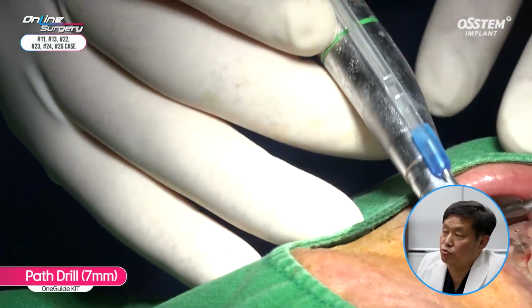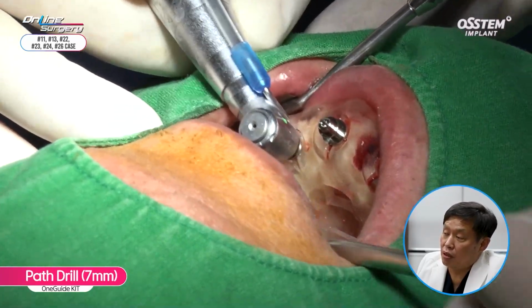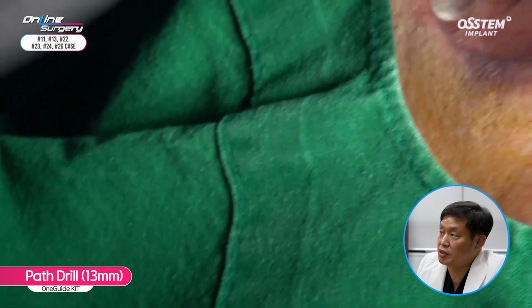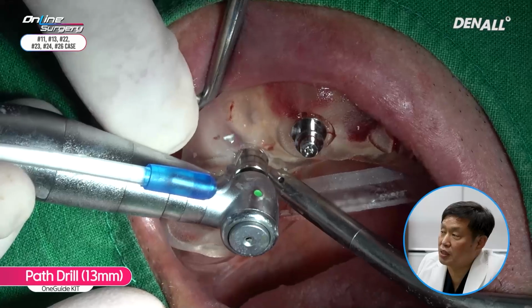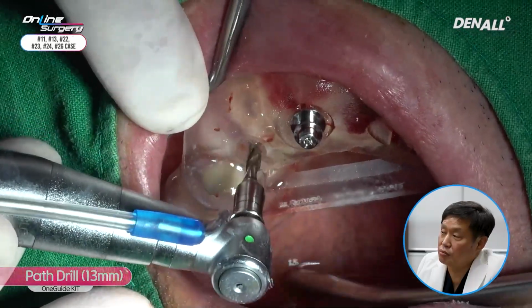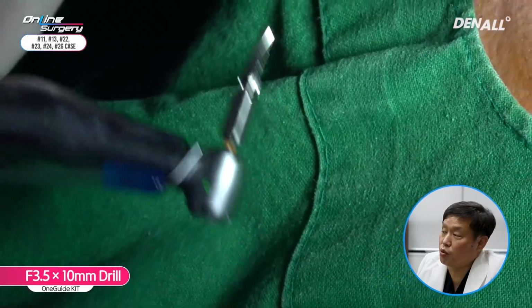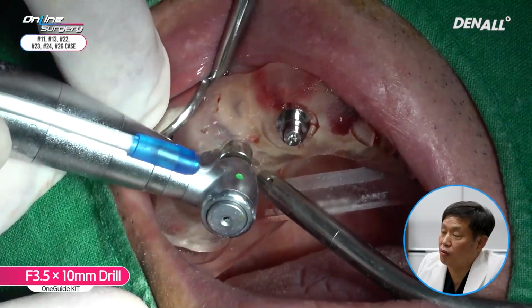The alveolar bone was slightly sloped. In order to prevent any slipping, a path drill was used. A 7 mm path drill was used first, followed by a 13 mm path drill. In the canine area, the path drill was used up to 10 mm, and then the 3.5 by 10 mm OneGuide drill was used.